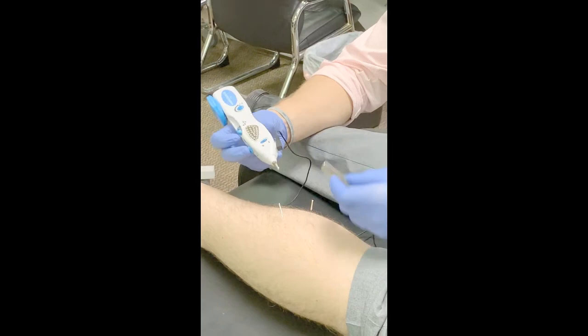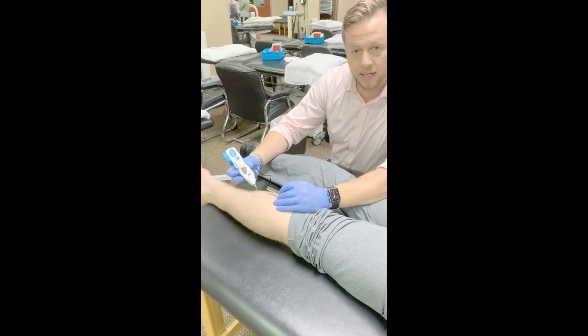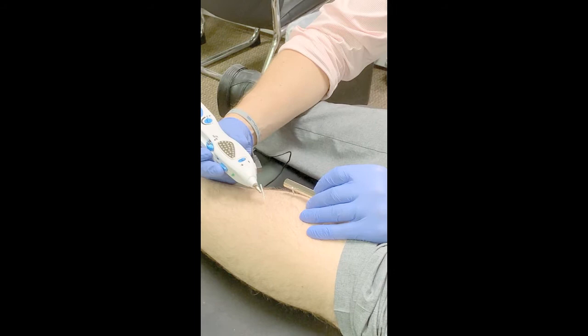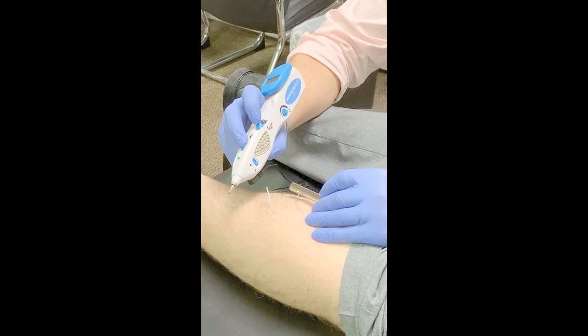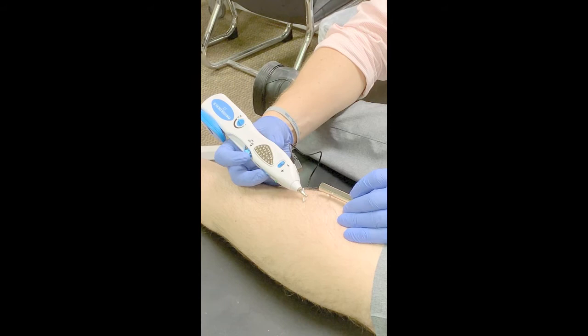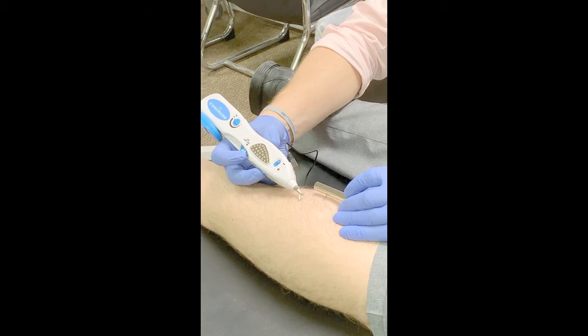So first let me just demonstrate — I have two needles in the medial and lateral gastroc. For metal-to-metal contact, your needles that have a metal handle can conduct through the handle, otherwise you'd have to conduct through the shaft. So making metal-to-metal contact and holding the trigger, I will now slowly increase the intensity until we have achieved a motor response. From there, it's based primarily on patient comfort.